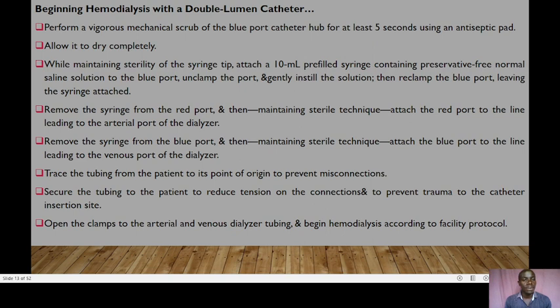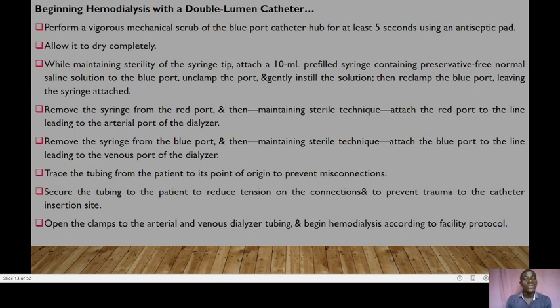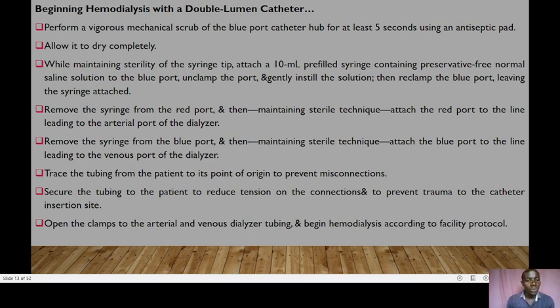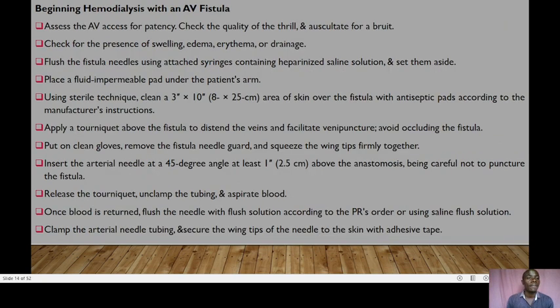Remove the syringe from the red port using sterile technique and attach the red port to the line leading to the arterial port of the dialyzer. Remove the syringe from the blue port and attach the blue port to the line leading to the venous port of the dialyzer. Trace the tubing from the patient to its point of origin to prevent misconnections. Secure the tubing to the patient to reduce tension on the connections and prevent trauma to the catheter insertion site. Open the clamps to the arterial and venous dialyzer tubing and begin hemodialysis according to facility protocol.